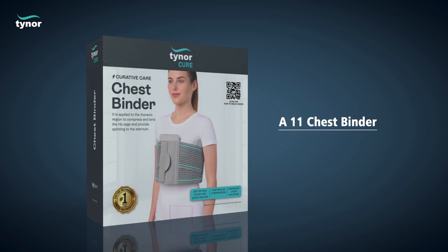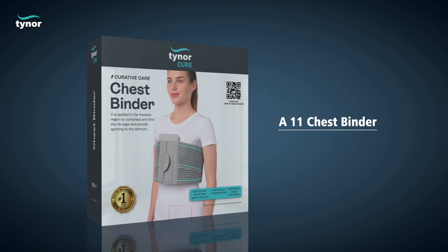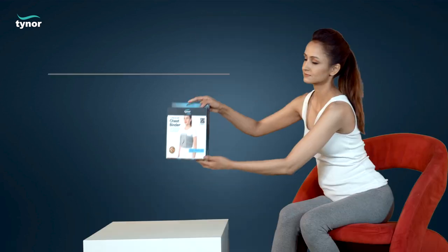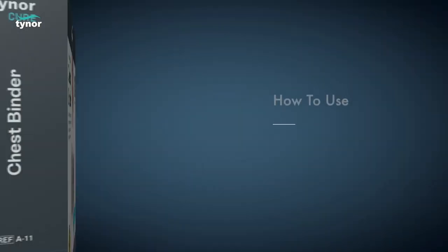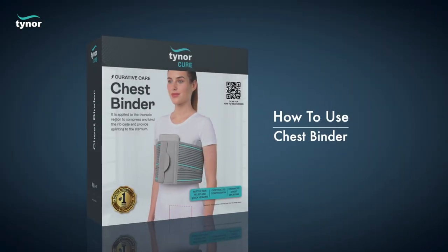Here we will discuss how to measure the size and how to use the chest binder. The chest binder comes in these sizes. Now let us see how to use the chest binder.